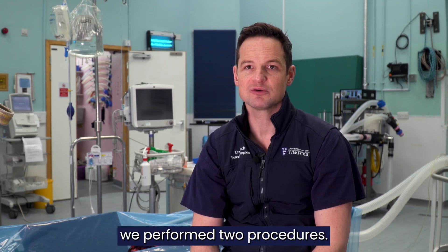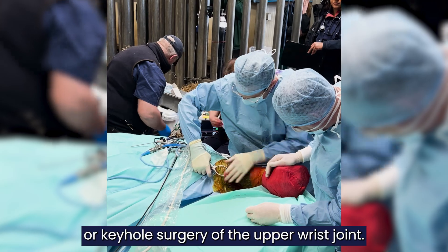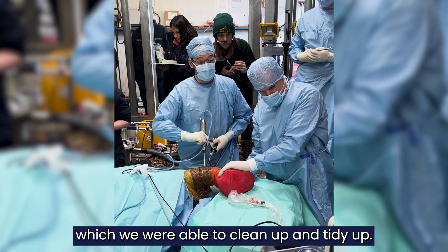To remove the fragment we performed two procedures. Firstly, arthroscopic or keyhole surgery of the upper wrist joint. This identified areas of cartilage damage and injury which we were able to clean up and tidy up.